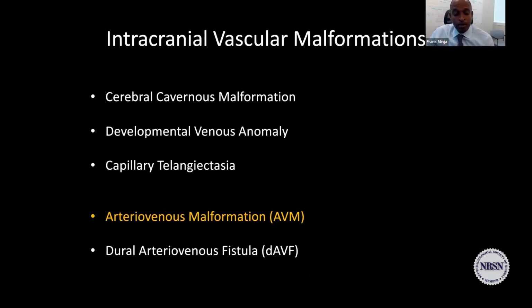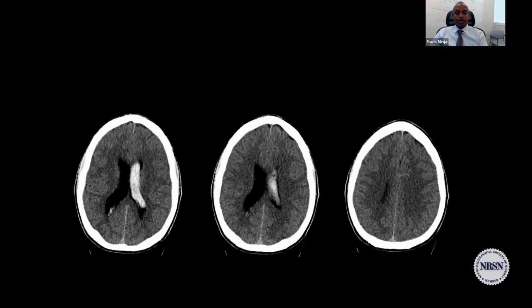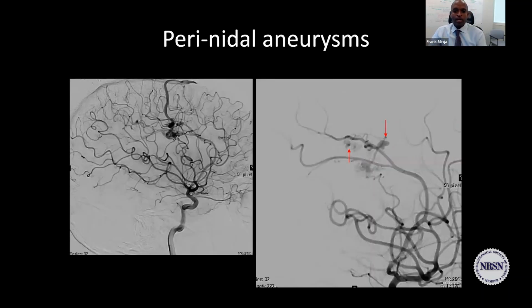So again, I was showing you that small AVMs can cause a lot of trouble, right? That little AVM is what causes a huge hemorrhage. So when you have huge hemorrhages, don't think you must have a ginormous AVM. Small AVMs can cause a lot of havoc because they are very fragile. The nidus is a fragile structure, because these are abnormal vessels. They're not normal vessels, so they tend to rupture easily, especially in the setting of hypertension.